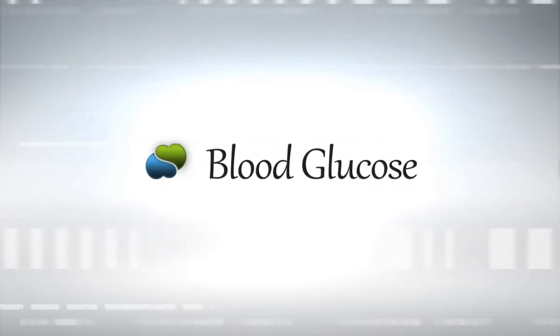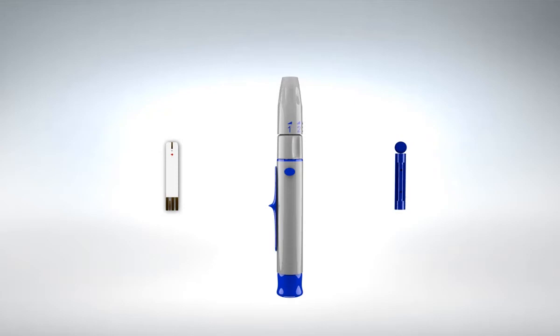Blood Glucose. In order to test your blood glucose level, please prepare the lancing device, the lancet, and a new glucose strip.